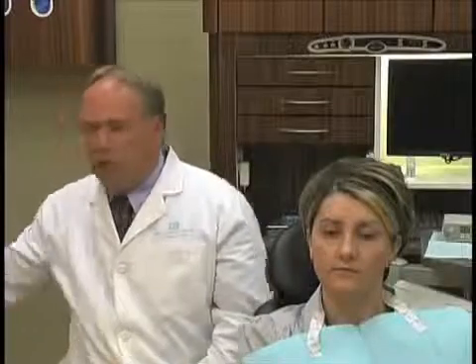So what I want to do is also go over with you some of the things in this records gathering process with the occlusal analysis, what the doctor needs to do and what the team can really do for the doctor. To me, it is absolutely critical that the doctor does centric relation records, that they are the person that finds, verifies, and records that.